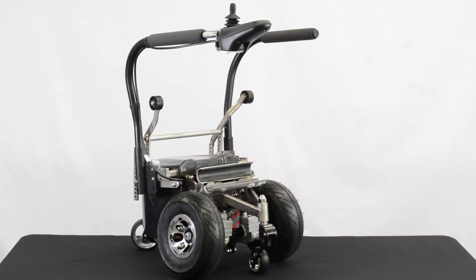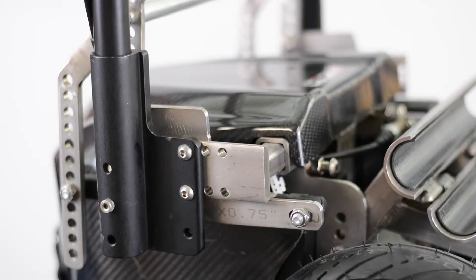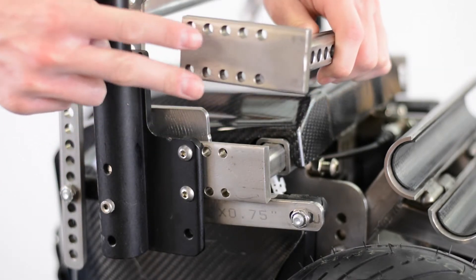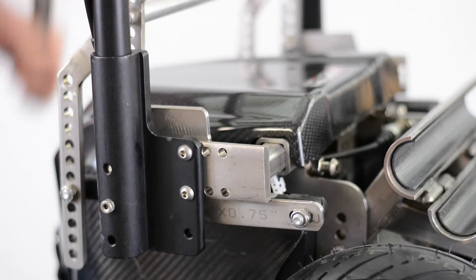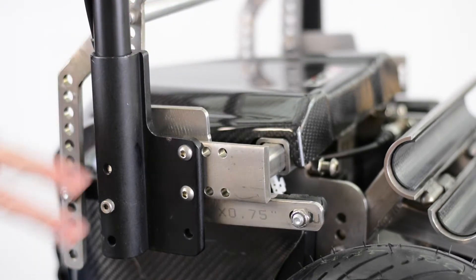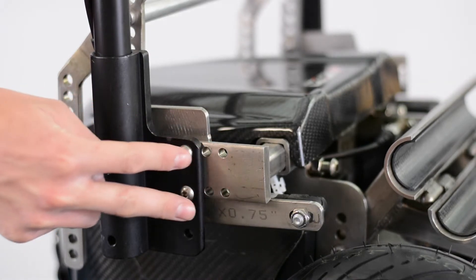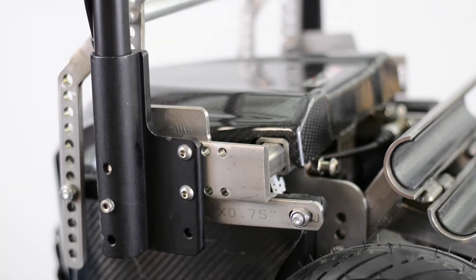The ZX-1 can be adjusted to accommodate a chair with a center of gravity ranging from negative 2 inches to positive 5 inches. To accommodate different centers of gravity, the ZX-1 has different holes that coordinate to specific levels of centers of gravity that we can adjust to. For example, the center of gravity in this configuration is 3 inches, denoted by seeing that the third hole is occupied by the bolts going through the black armrest bracket.